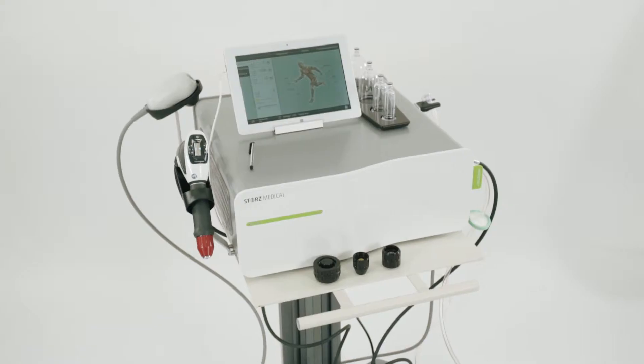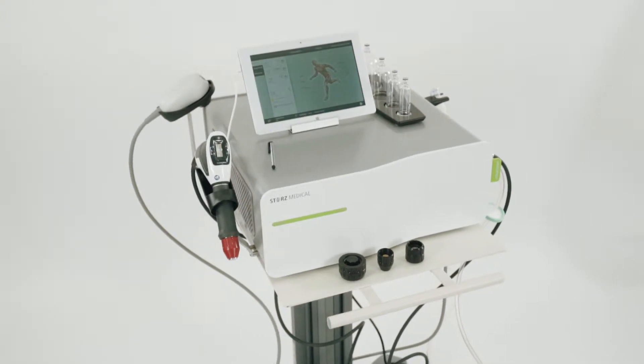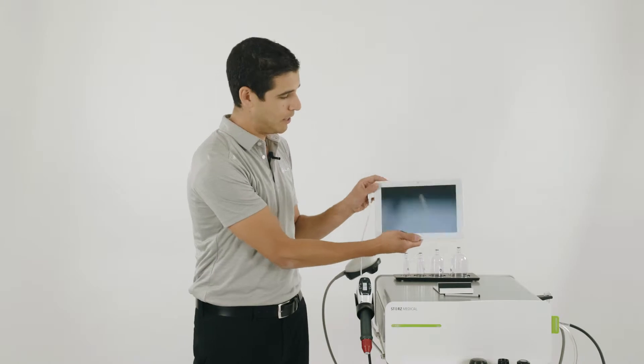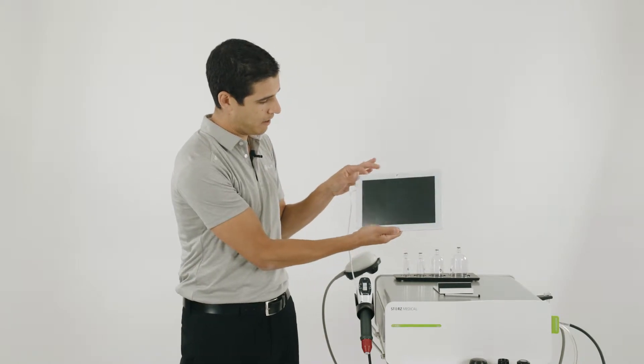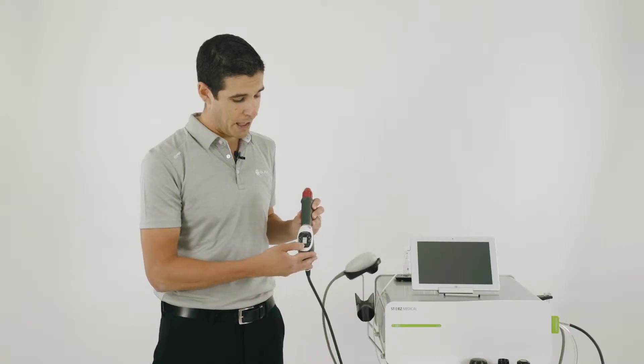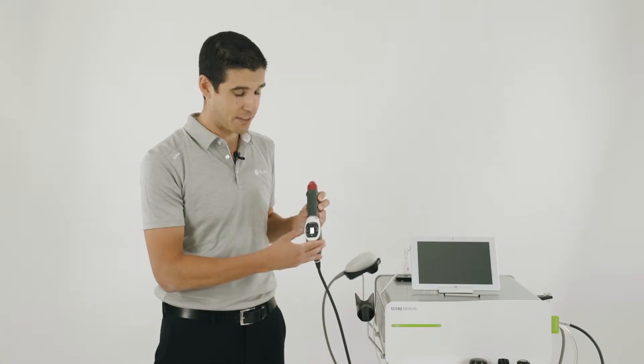Today we're going to look at operating the Stortz Medical MP200. Turn on the machine by pressing the button at the back. To turn on the tablet, hold the power button for five seconds until the Stortz Medical logo appears. Press the power button on the handpiece to initiate the compressor.